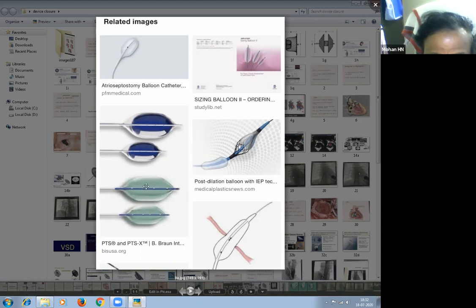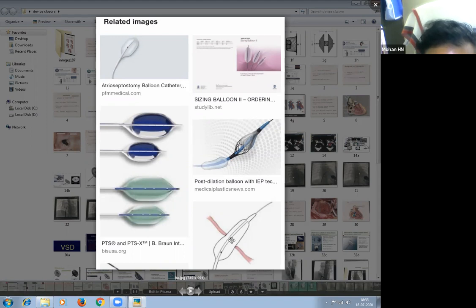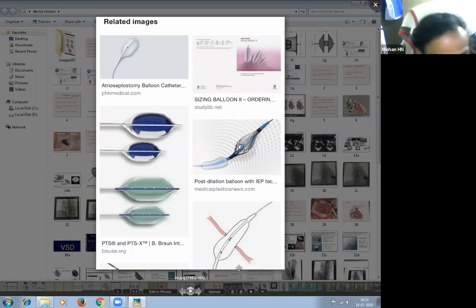This one, from here to here, it will take as 15 millimeter. You can take that. Here also you can see. So this is the 15 millimeter here, and another dot, that's the 2 millimeter. The computer will take this as a reference. Even manually we can measure.